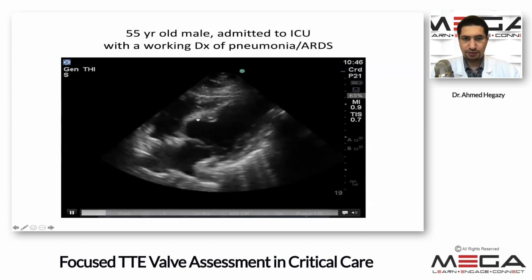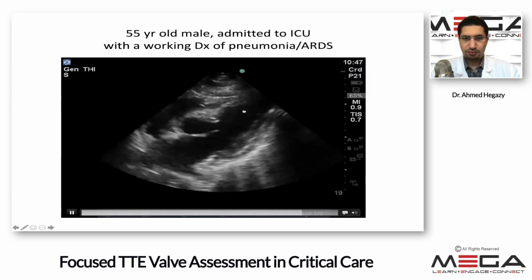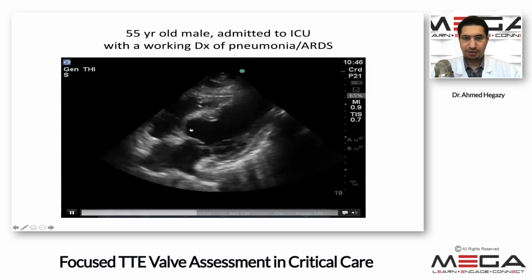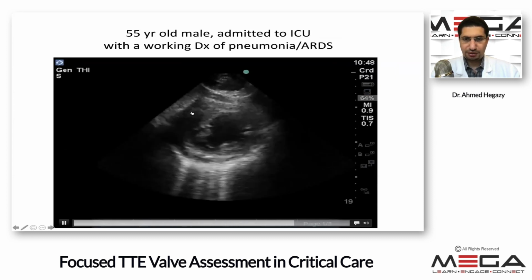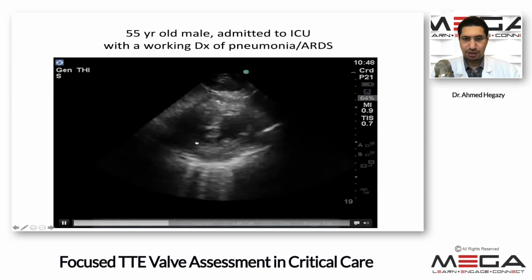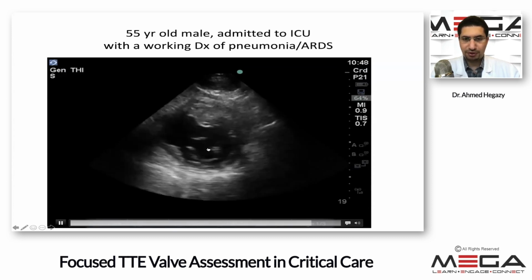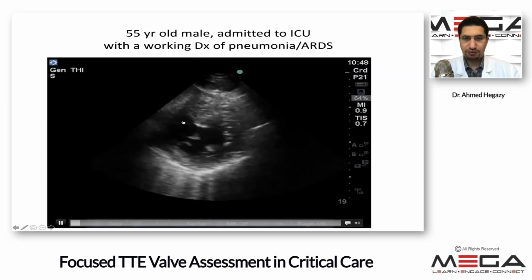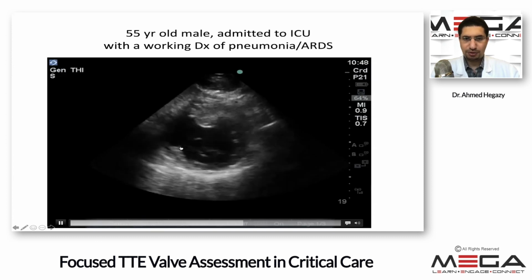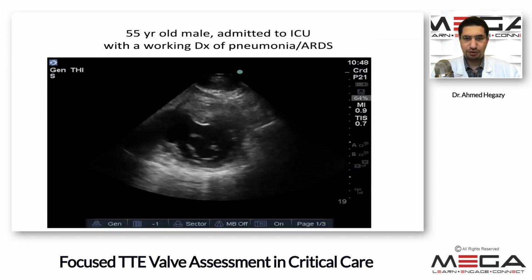This contour of the base of the left ventricle looks somewhat abnormal. I will get to that in a second, but normally the left ventricular endocardial border is more smooth, and you don't see this outpouching at the base of the left ventricle. Here, I'm looking at a parasternal short axis. It looks like the contractility at the mid-papillary level is normal. This is quite pleasing. But then as I tilt my probe up in a parasternal short axis at the basal level, here I see more the mitral valve. At the basal level, I see this outpouching that I was seeing in my subcostal view. This is a basal aneurysm. This is an infrabasal aneurysm, and this patient actually had an aneurysmal outpouching of his base.